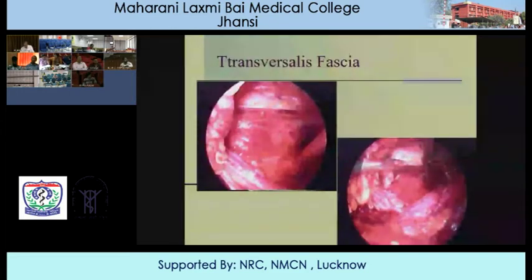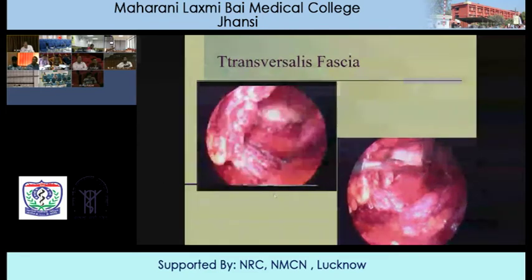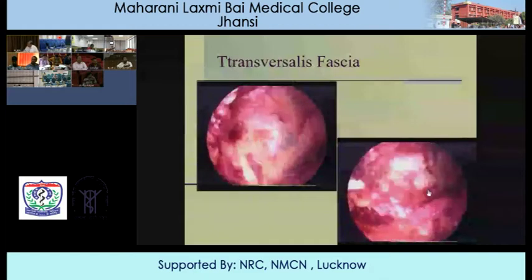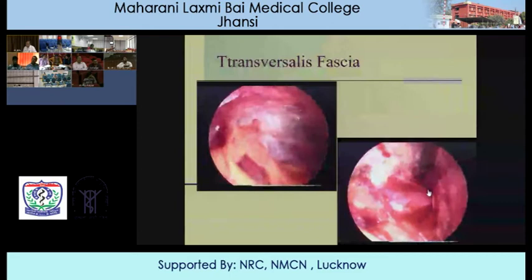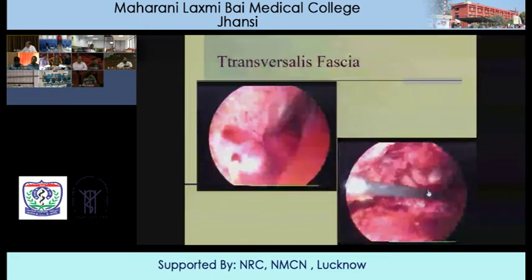Just to give you an idea. See, it's a very substantial fascia. See that fascia being cut laparoscopically. It's a simple thin layer, and you hardly see any bleeding out here. Do you see any bleeding? No. The same thing is now being cut. We're going to the right plane.